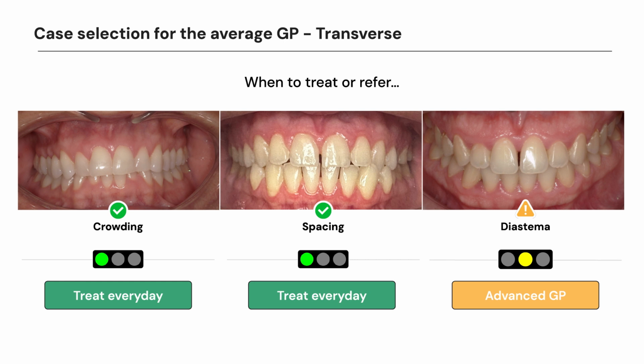And then the last picture, all right, there's that diastema we talked about. All the teeth are tight down in the bottom, no space, but there is that gap up top. The only way we can close that gap up top to squeeze those teeth together is to make there less enamel on the bottom, to actually take away some tooth structure via IPR in order to get those teeth to close. So you want to think about how you want to manage that. Can you do it? Yeah, you can. A little bit more of an advanced skill set for us, but maybe you want to do it by moving the centrals together, leaving a little space by the laterals, doing some bonding then to get those back to the proper size, or maybe veneers, etc., and not doing any IPR on the bottom, which is the way I'd prefer to do it.